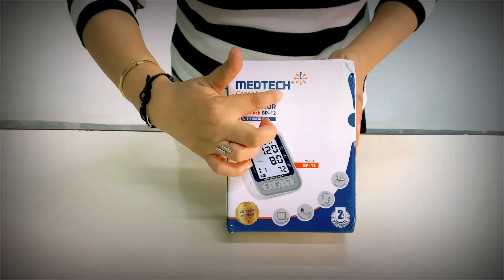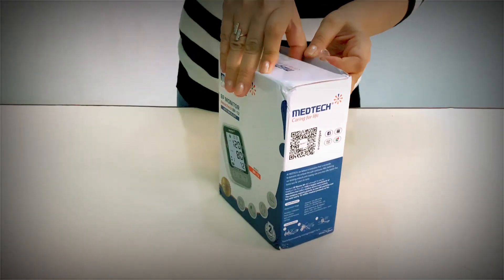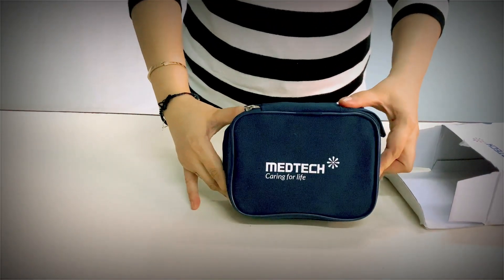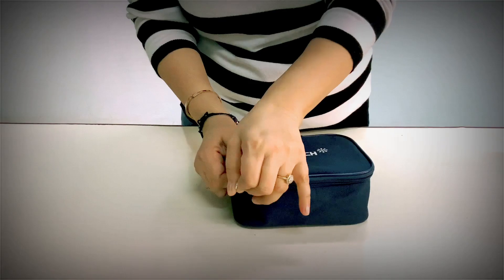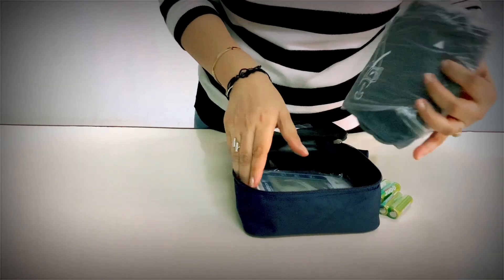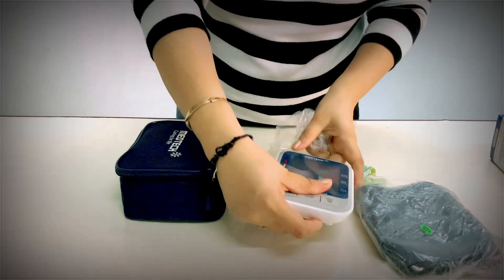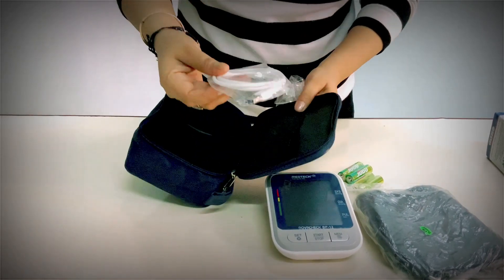This is a BP instrument from Medtech. These are batteries. This is the cuff. And this is the digital monitor. This is to charge the digital monitor.